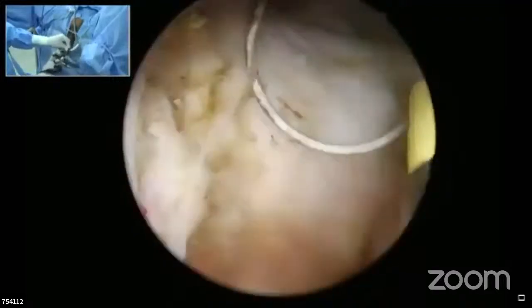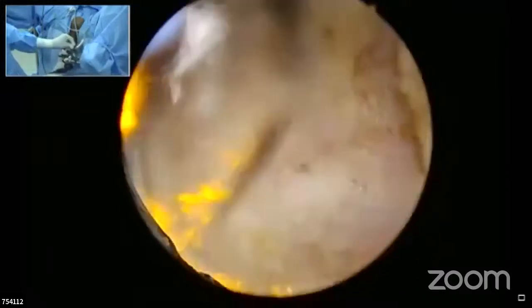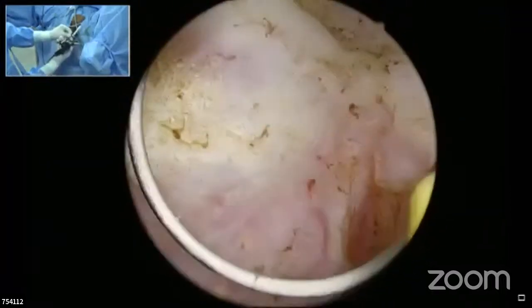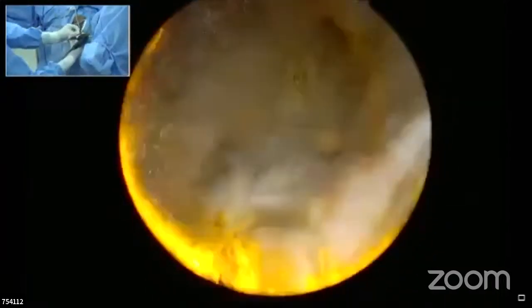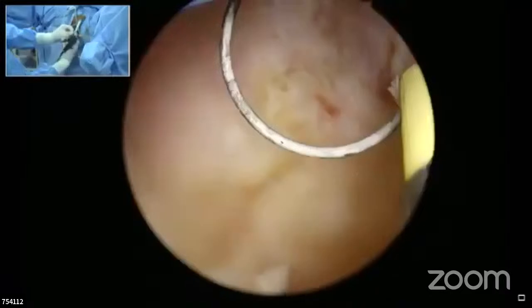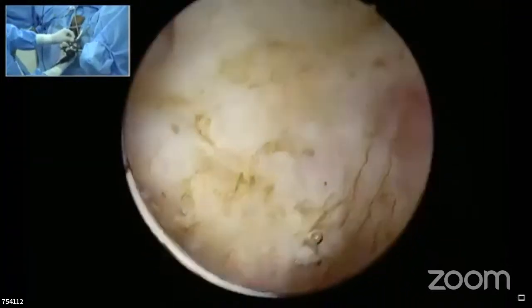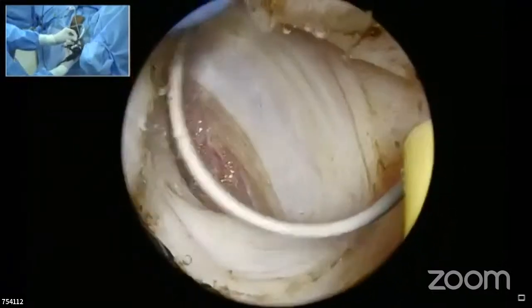Sir, may I ask what is the incidence of stress incontinence in large glands? If you have apical lobes extending far beyond the verumontanum, and you're not careful doing the apical lobes, there could be an incidence of incontinence. Stress incontinence after a large prostate may be there for a couple of days, maybe a few days, but should not really be a matter of concern.